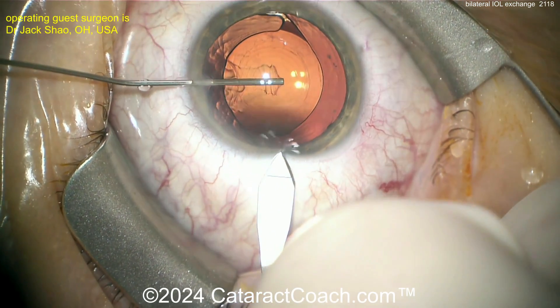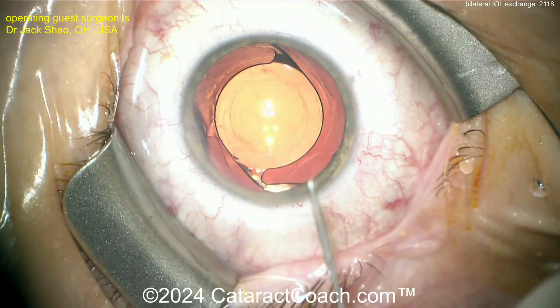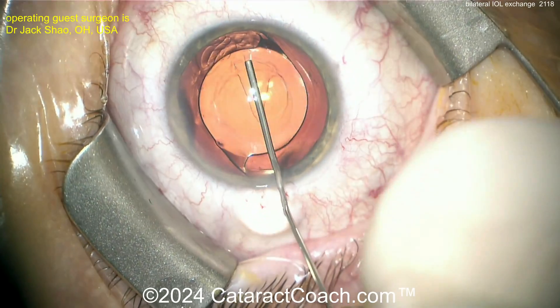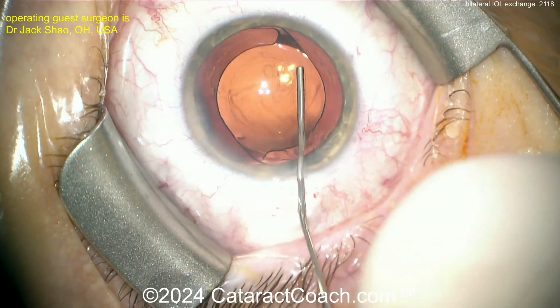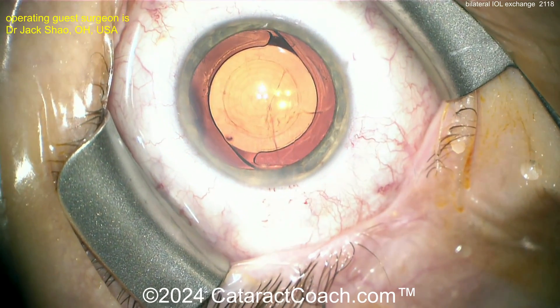Here's the trifocal or multifocal lens in the capsular bag. Making an incision, entering the eye, nice fill of viscoelastic. The key is to really take your time separating this lens out. We've sped up all the videos, but a little bit of visco dissection is important.